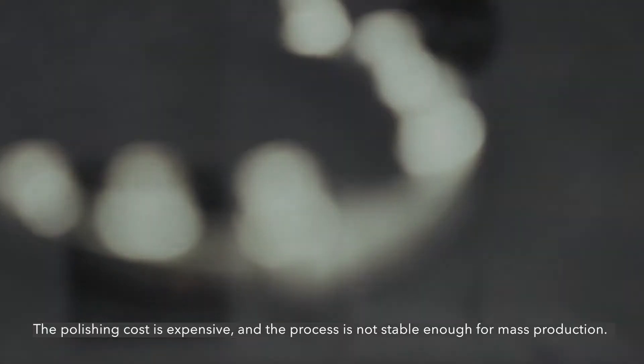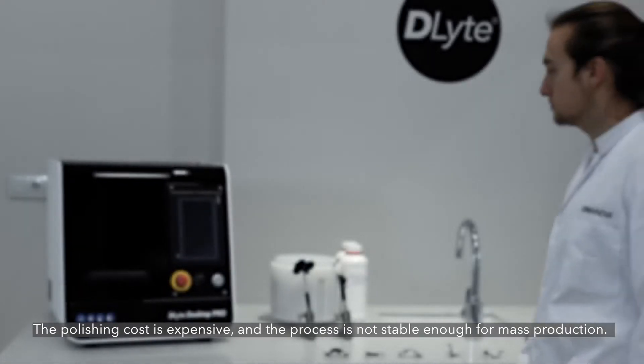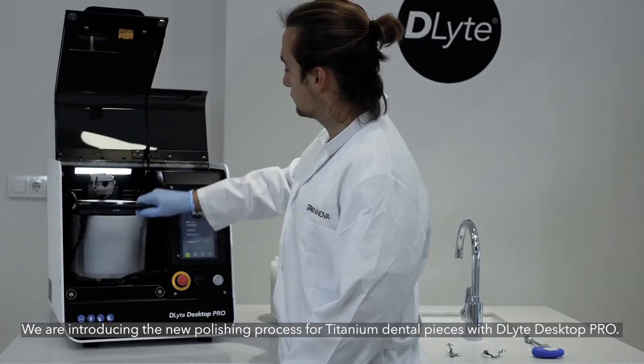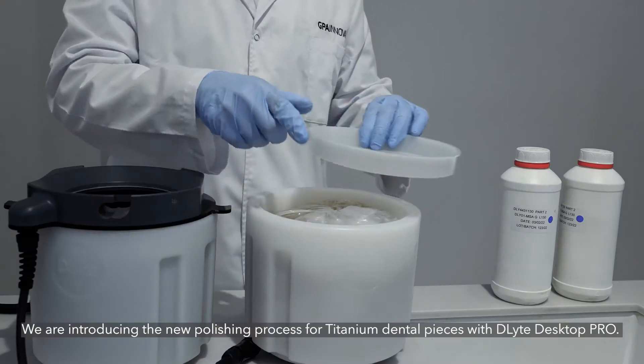The polishing cost is expensive and the process is not stable enough for mass production. We are introducing the new polishing process for titanium dental pieces with D-Lite Desktop Pro.